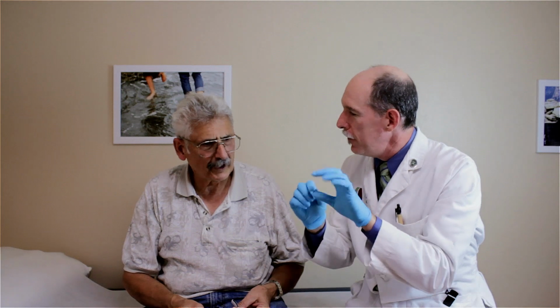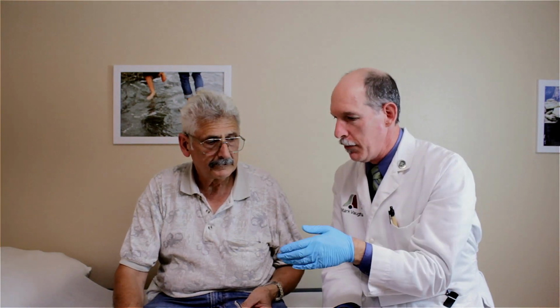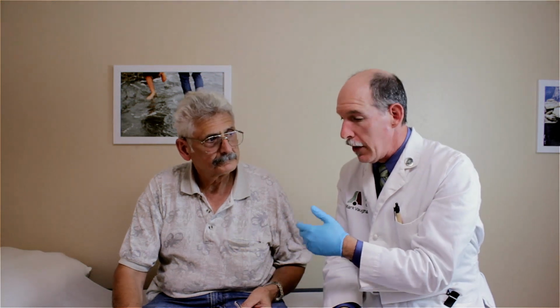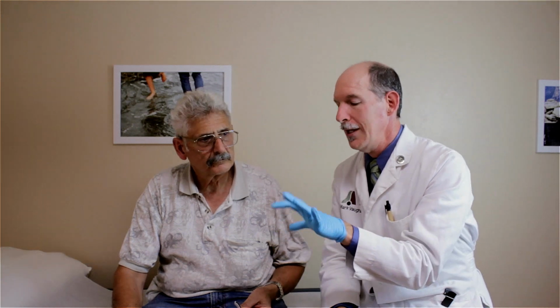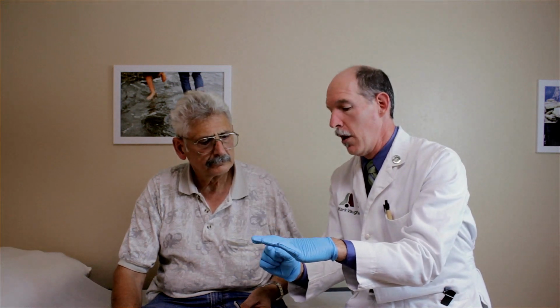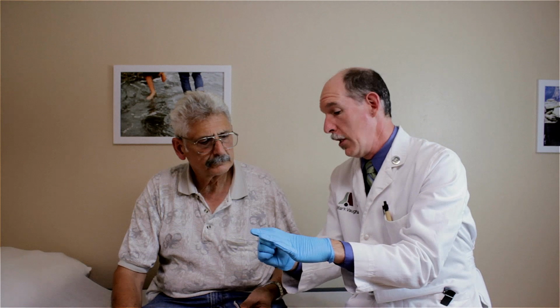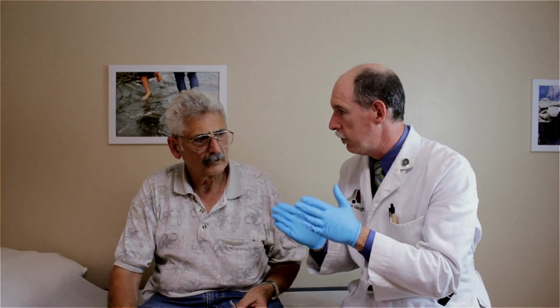And I shouldn't try to take it out myself? Well, no, because you can't see it. I know, but all I can do is feel it, and I could maybe injure it. The thing I would say to anybody who wanted to take this out themselves is the concern is rupturing the eardrum. So if you can confidently see it, and that's why we have the instruments we have here, and some people may have access to good magnification and something small like our forceps, to be confident that they're grabbing it and pulling it out without injuring the sides or the eardrum. That's the problem.